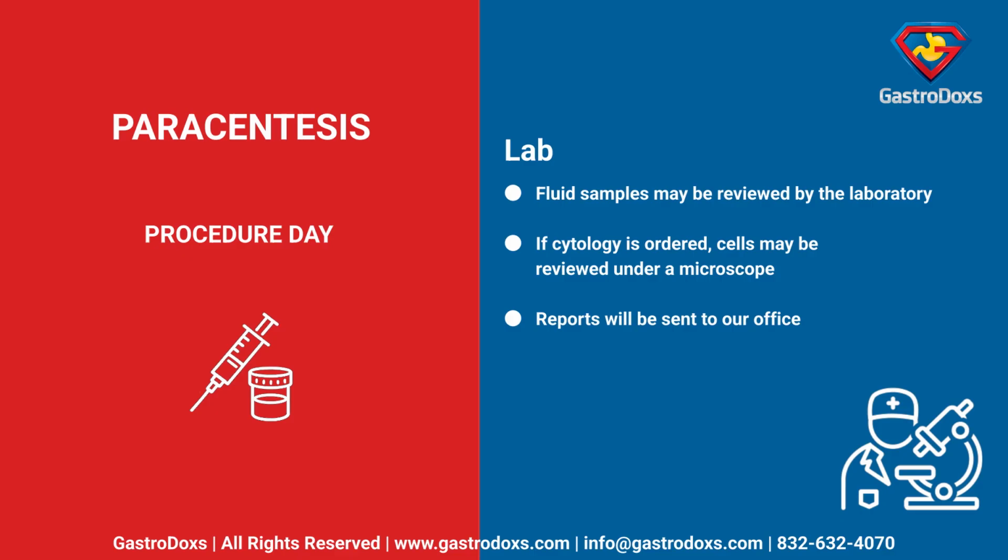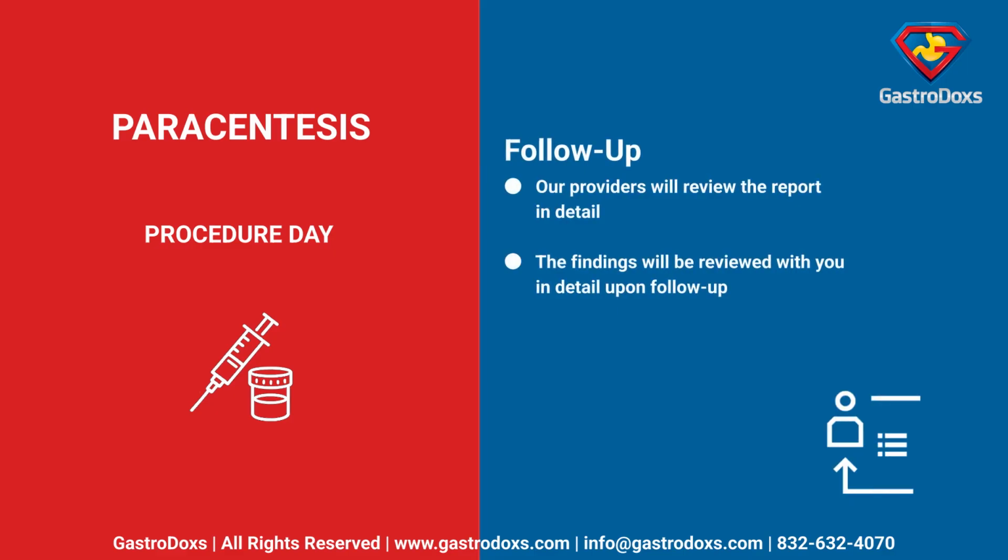Lab. Fluid samples may be reviewed by the laboratory. If cytology is ordered, cells may be reviewed under a microscope. Reports will be sent to our office. Follow-up. Our providers will review the report in detail. The findings will be reviewed with you in detail upon follow-up.